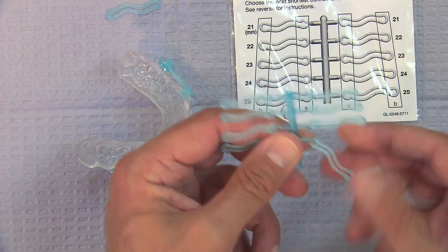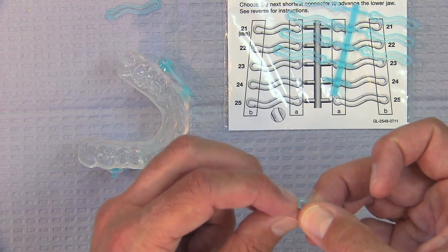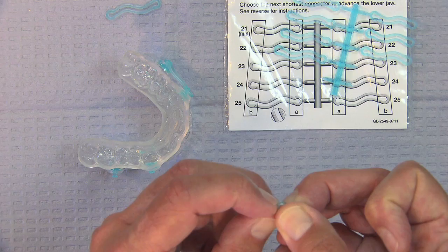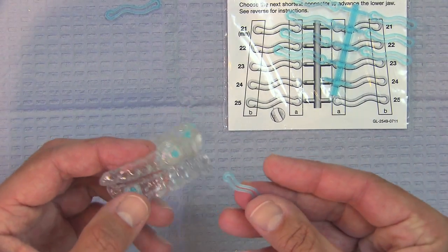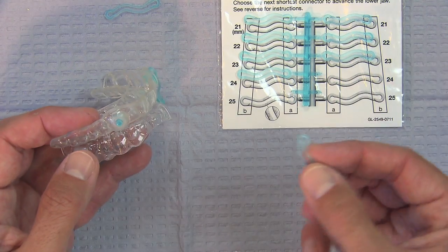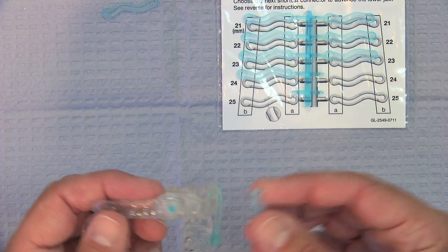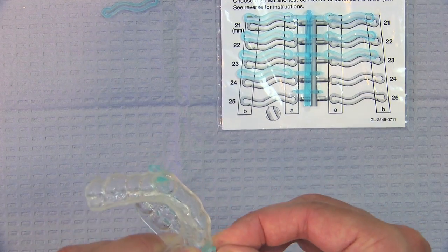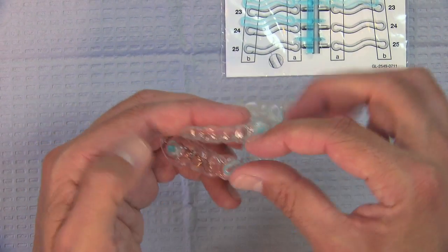If you twist it, they come off pretty cleanly, but on the back on the instructions it'll show if there's a little nib there, you can go in and break it off with just a little sharp pen knife or something like that. And then the A and the B sides are different. The A side is the one that's rounded, because that's the one that actually locks on to the upper appliance. So you push it on like that and then pull it down to link it into place.